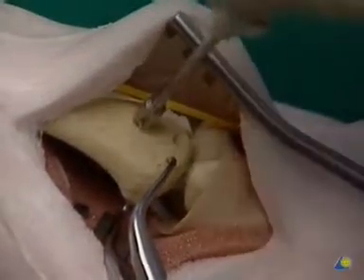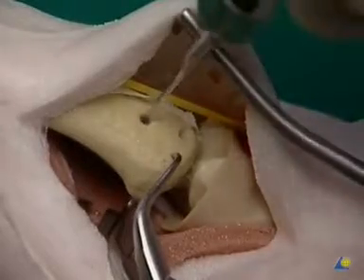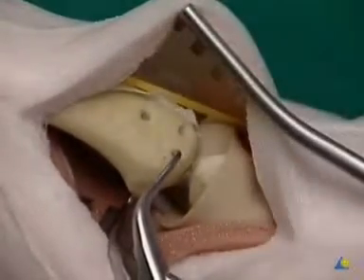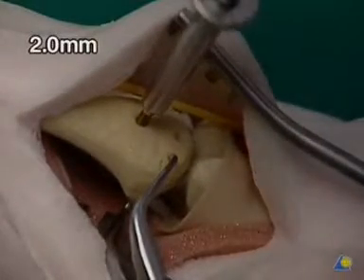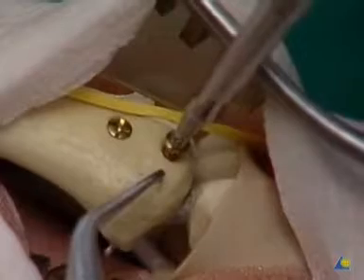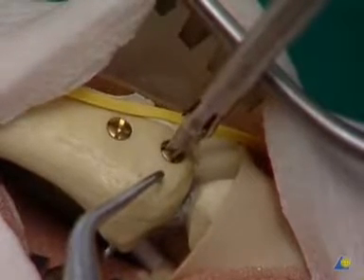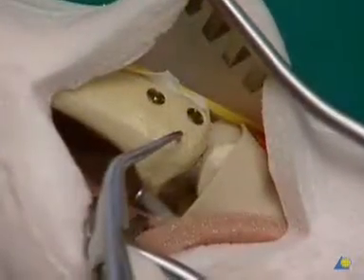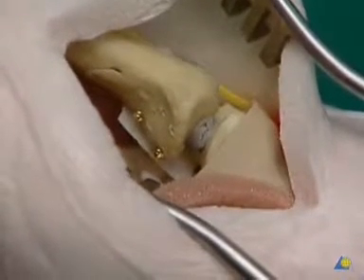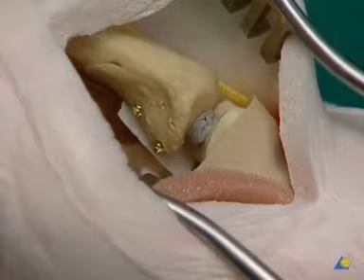With the countersink, the space for the screw head is cut out and the depth is measured. A self-tapping 2 mm screw is inserted as a lag screw. The second lag screw is inserted in the proximal hole; because of the cancellous bone structure here, countersinking is not necessary. Tightening of both screws applies good compression to the fracture. By turning metacarpal one back into place, the tips of both screws become visible, protruding from the far cortex by one to two turns of the thread. The reduced articular surface is smooth.